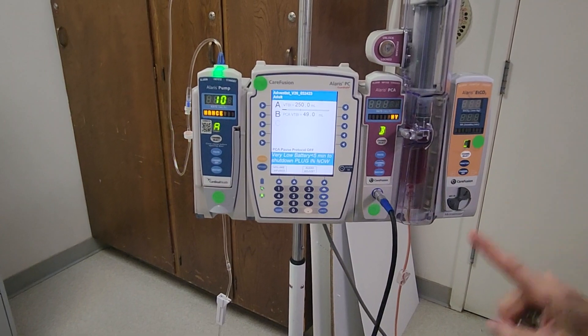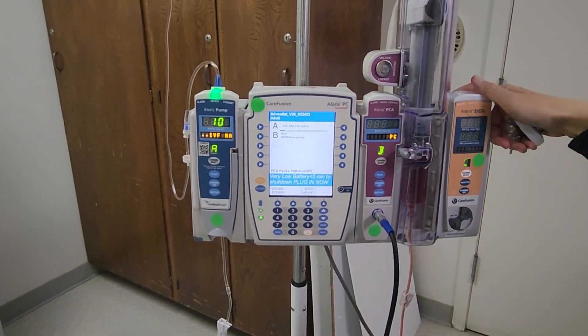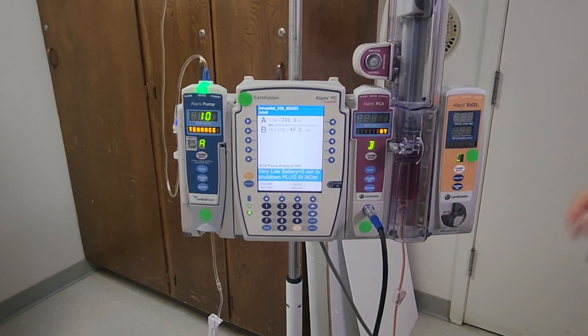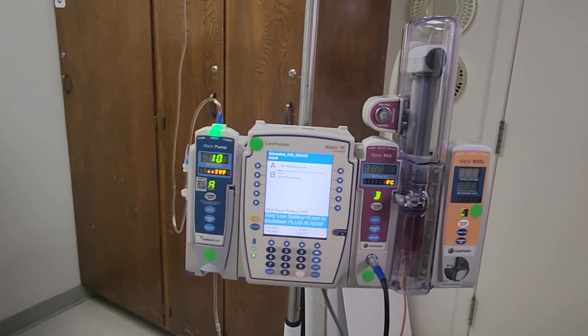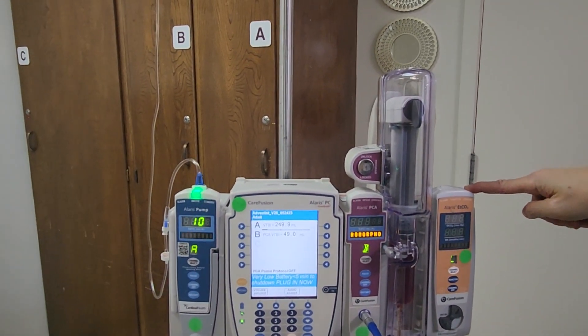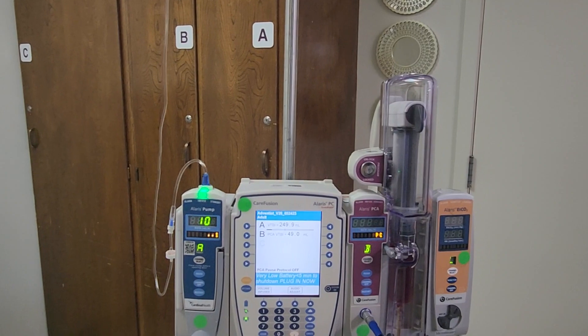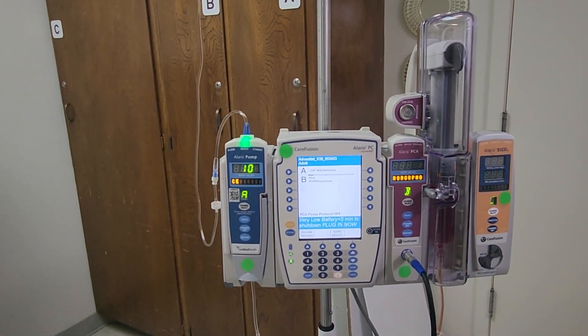We have not yet attached our end tidal CO2. Per hospital policy, patients on a PCA must have continuous pulse oximetry as well as this end tidal CO2 tubing attached.